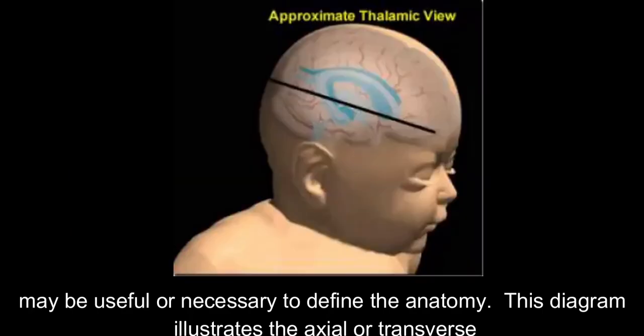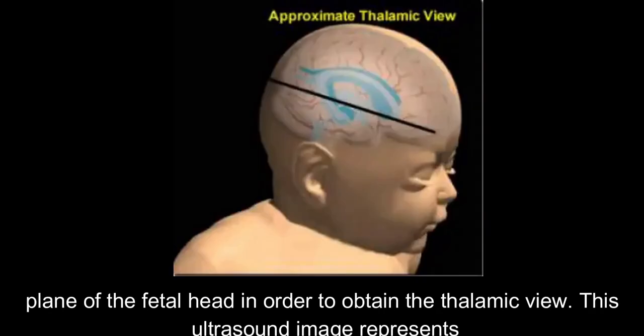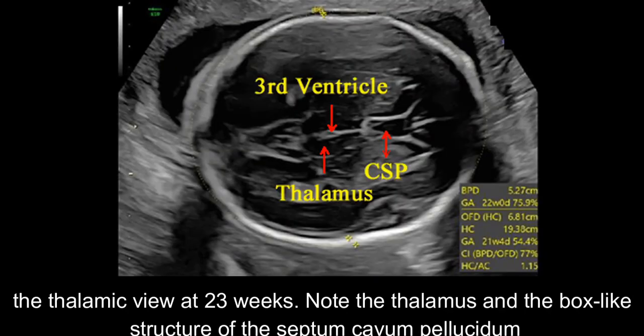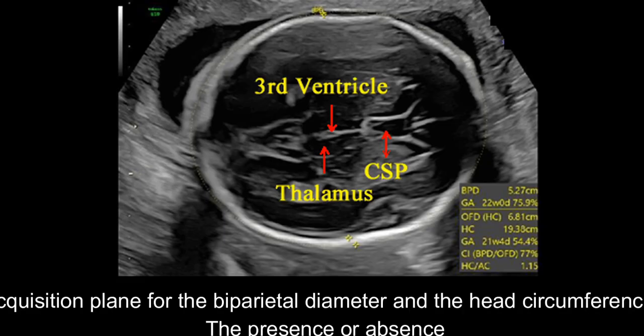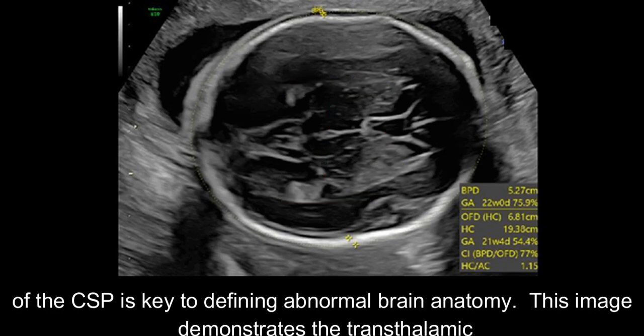This diagram illustrates the axial or transverse plane of the fetal head in order to obtain the thalamic view. This ultrasound image represents the thalamic view at 23 weeks. Note the thalamus and the box-like structure of the cavum septi pellucidae, CSP. The cerebellum should not be visualized in this plane. The transphalamic plane is the acquisition plane for the biparietal diameter and the head circumference. The presence or absence of the CSP is key to defining abnormal brain anatomy.